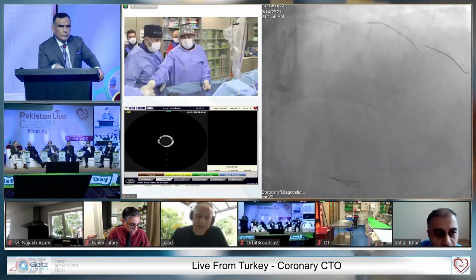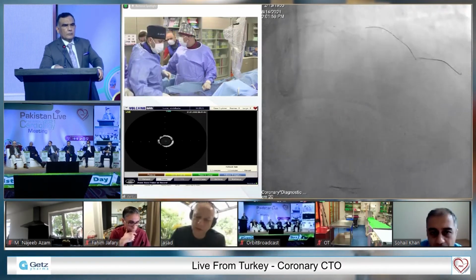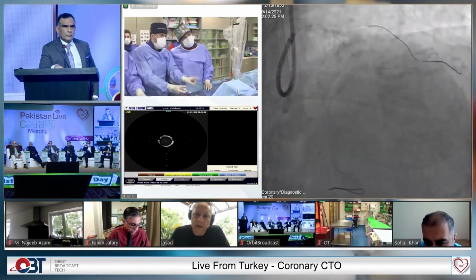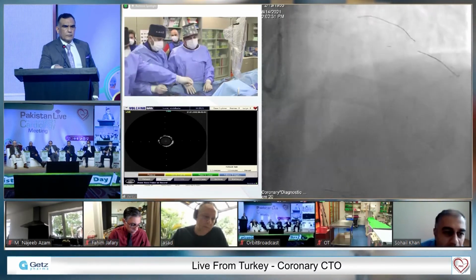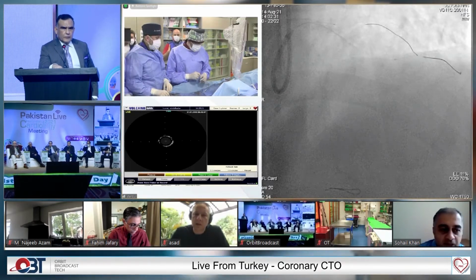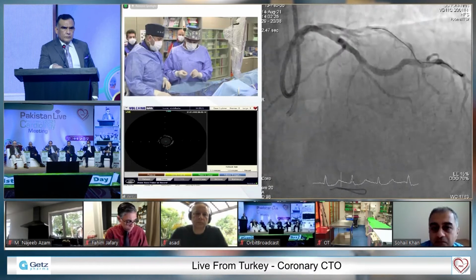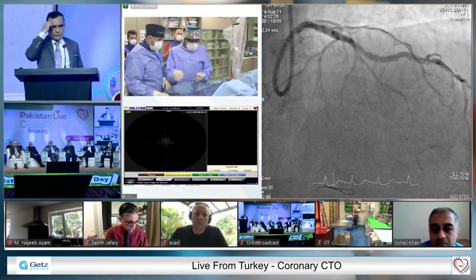I think just to clarify, for the Fielder XT it would not be microchannels, but knuckling down with a planned antegrade dissection strategy. We are very close now. You're in the architecture of the vessel here. Yes, for sure, clearly not in the lumen. And I'd like to thank Asad. Good comment.